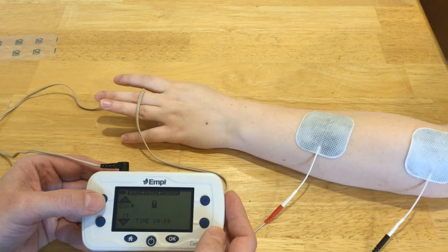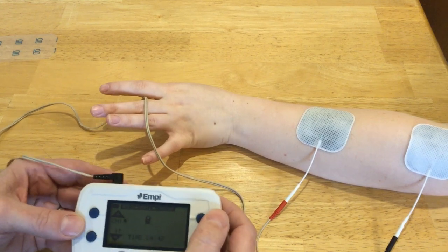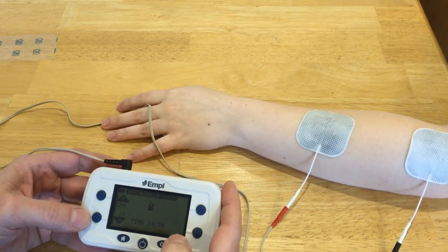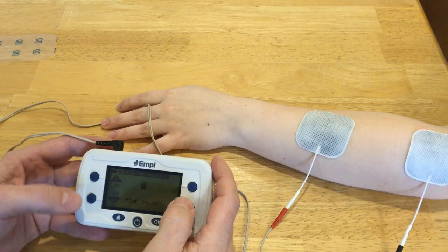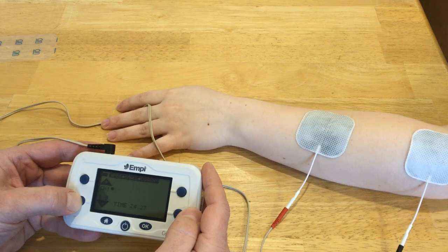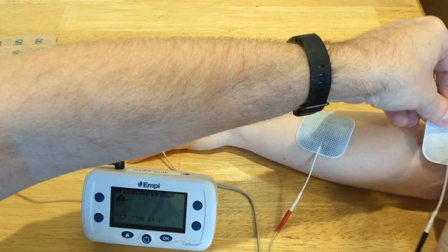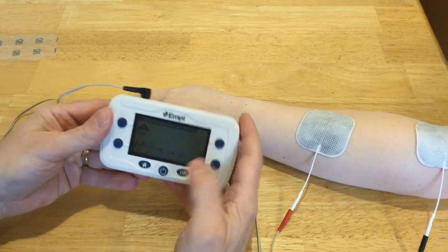It'll turn off for a few seconds and then come back on, and there we have a nice extensor digitorum. We also have some extensor carpi ulnaris, so I'm probably more lateral with my active electrode than I want it to be. I'm going to turn down the intensity so I can reposition the electrode a little bit more medial and see if we can get a wrist extensor going.